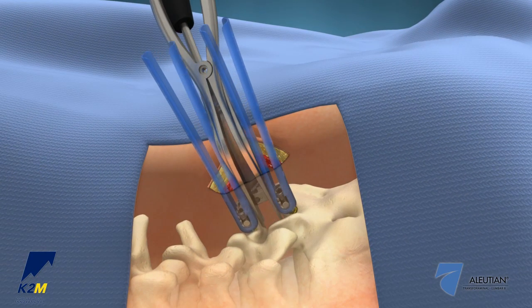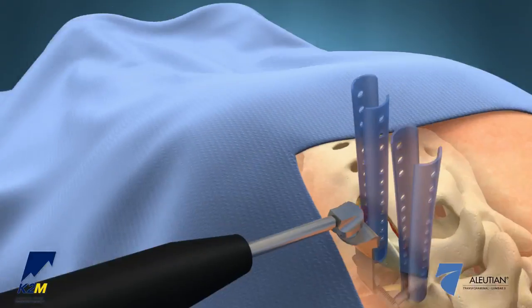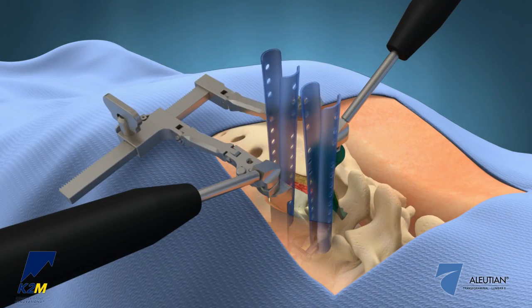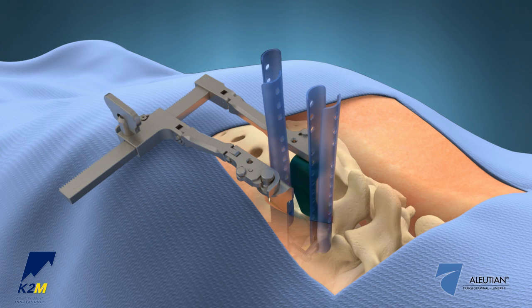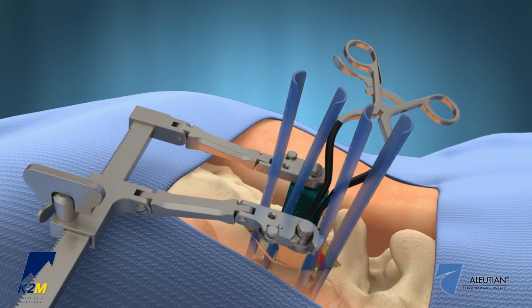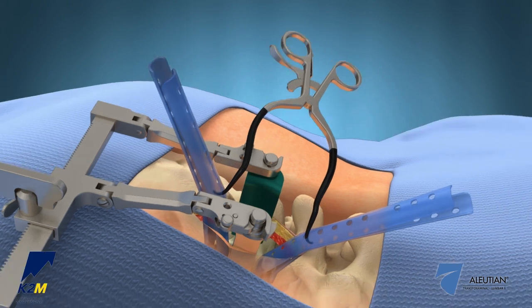Next, distract the disc space using the angled distractor. Engage the retractor frame to the quick connect features of the retractor distractor blade and the medial blade. Ratchet the frame to the desired position to sweep the tissue medially over the facet. Place a Gelpi retractor between the Serengeti retractors for cephalad caudal retraction.